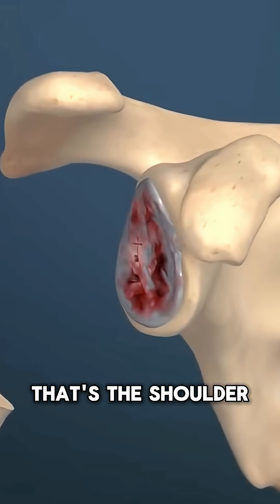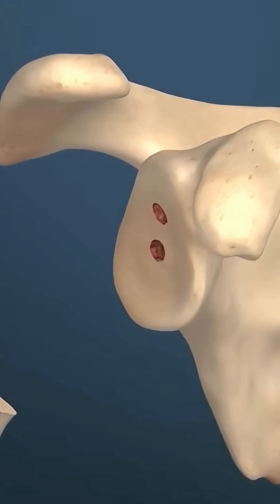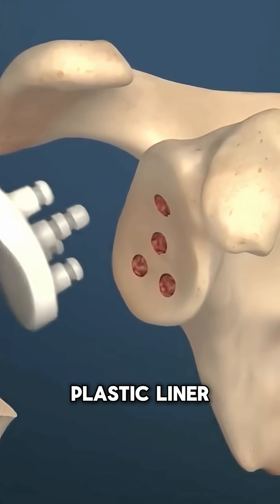Next, the glenoid — that's the shoulder socket — is cleaned, getting rid of worn cartilage and unhealthy bone. It is reshaped and then fitted with a strong plastic liner.